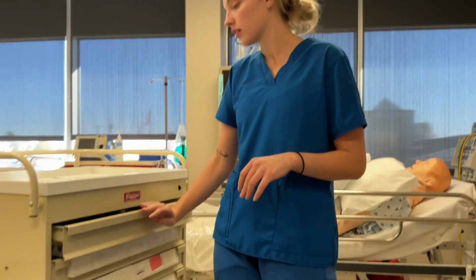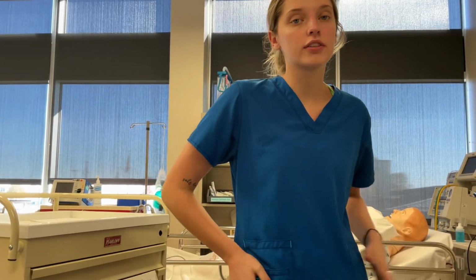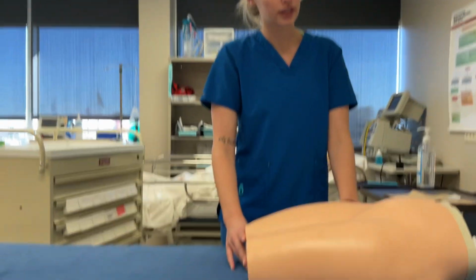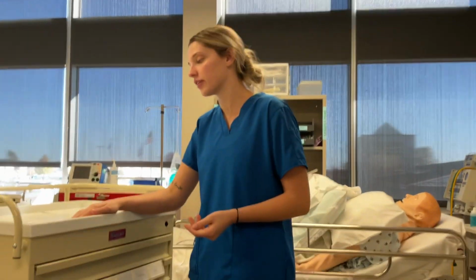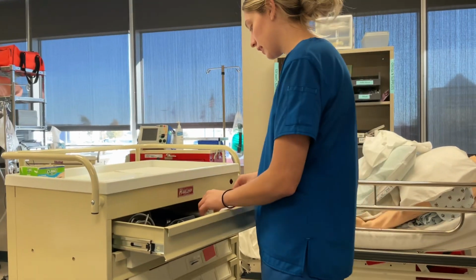I would ask my patient if they have a preference on what hip. Today we're going to be doing the right hip for the vastus lateralis greater trochanter, and make sure they are able to get this injection, which they are because it has not been given yet today. So now I'll go on to my first med check. So I'm just going to open the drawer and get everything out.